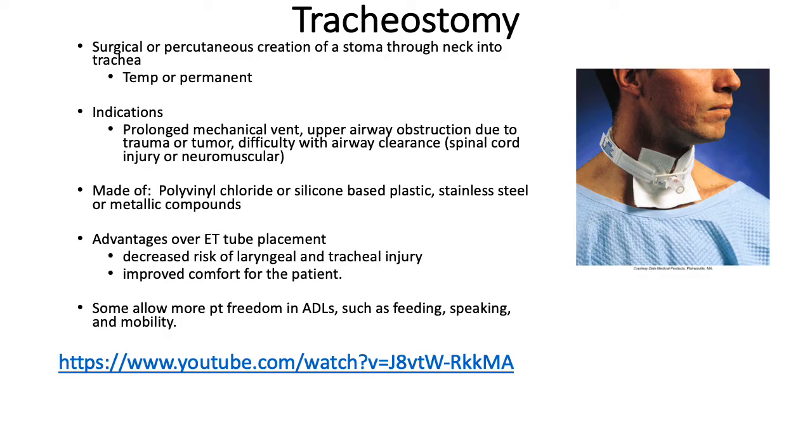Our focus will mostly be on tracheostomy tubes. A tracheostomy is a surgical or percutaneously created stoma through the neck into the trachea. It can be temporary or it can be permanent. A tracheostomy is used when a patient requires prolonged mechanical ventilation over the 7 to 21 days.